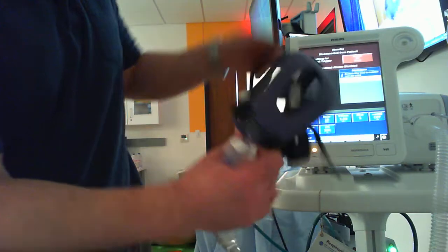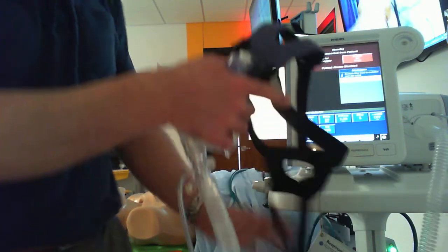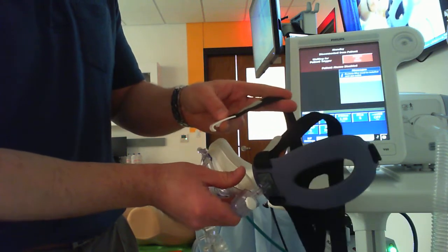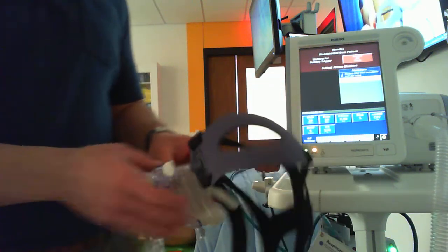There's ultimately 4 different connection points that happen to the mask, to this headgear. There's 2 up top and 2 down low, all right? We got the quick release straps here that you want to fully utilize, and we'll talk about those a little bit later on.